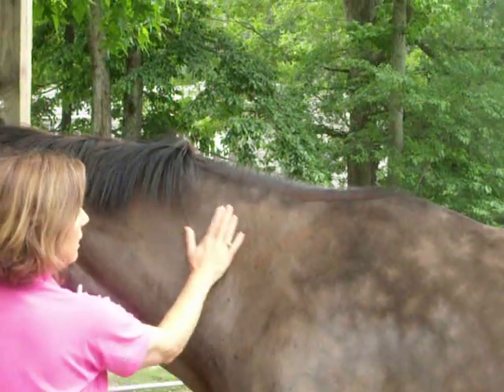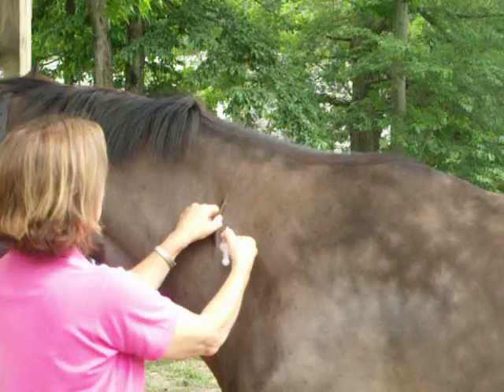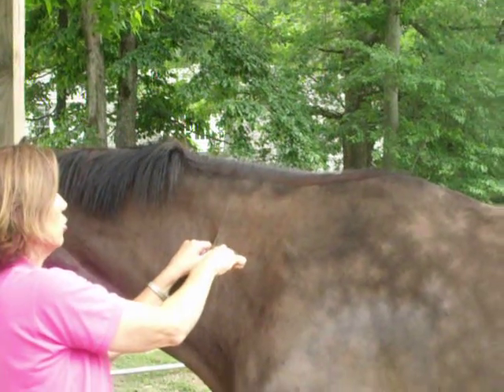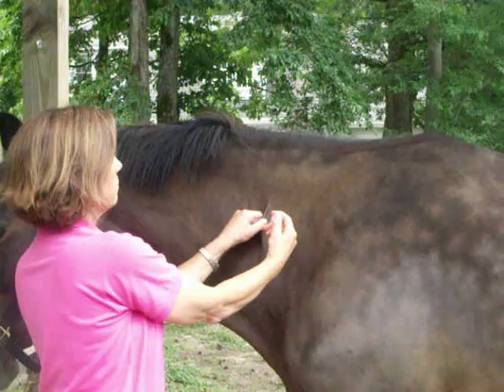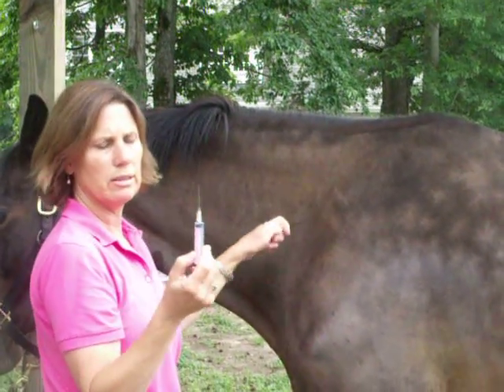What you're going to want to do is put the needle in straight into the muscle and draw back to make sure you have no blood, and then inject. Then just remove the needle.